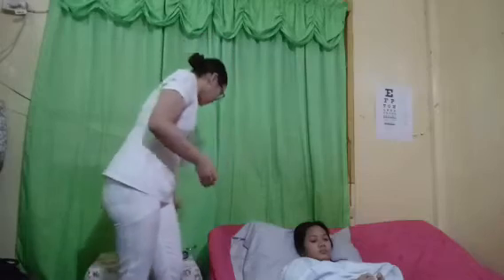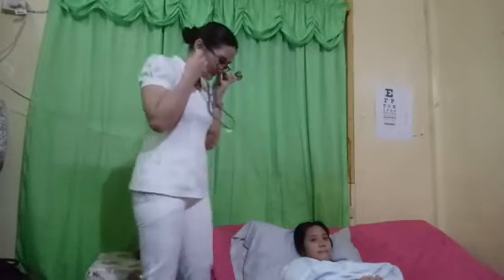Okay, so good. I don't see anything of concern at all. Now I'm going to be auscultating the patient's apex while listening to the rate and rhythm for a full minute. I'm going to be placing the diaphragm of the stethoscope onto the patient's apex. Yami, auscultate ko ha.